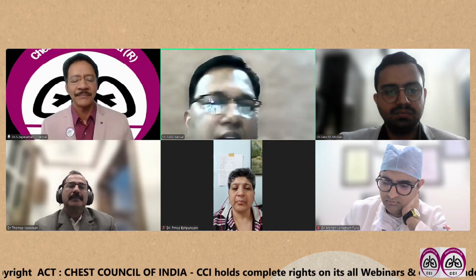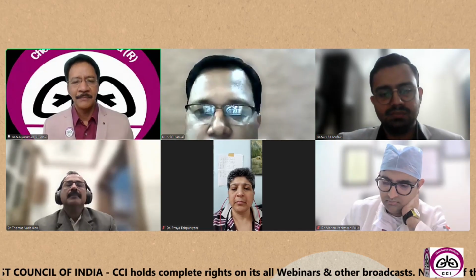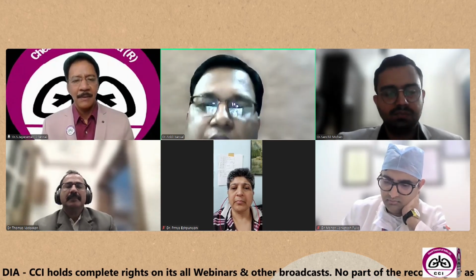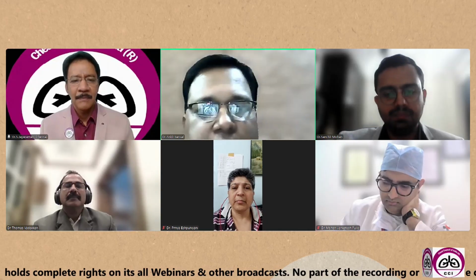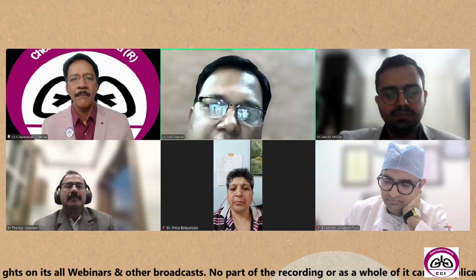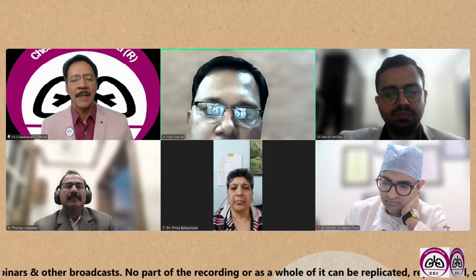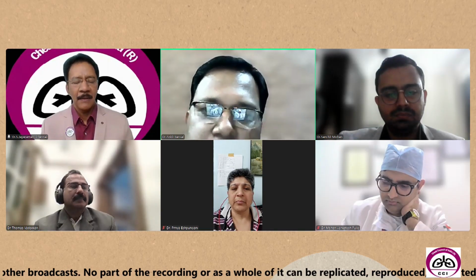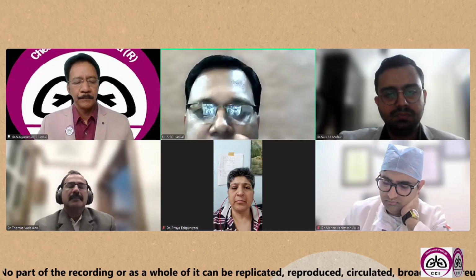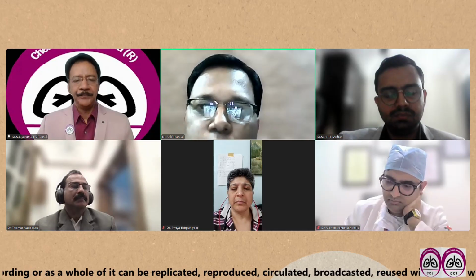Thank you, sir. Thank you, CCI, for giving the opportunity to speak on this respectable forum. Either we see CT scan or we see EBUS, the anatomy is relatively the same. But what we are working with are different planes. In CT, we have an axial plane, which is static and an external view, whereas in EBUS, it is a sagittal and oblique, but it is a dynamic view and it is endoluminal.